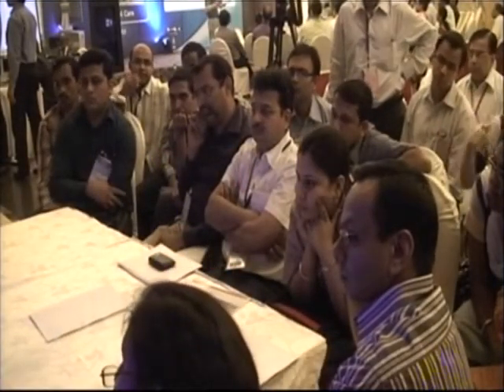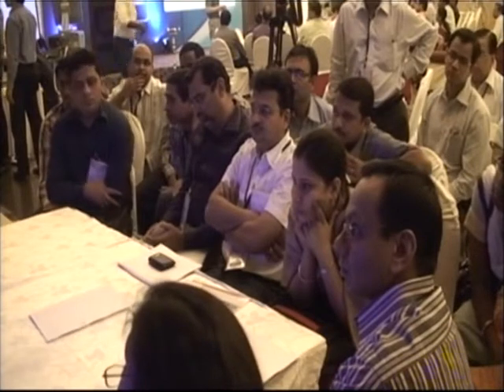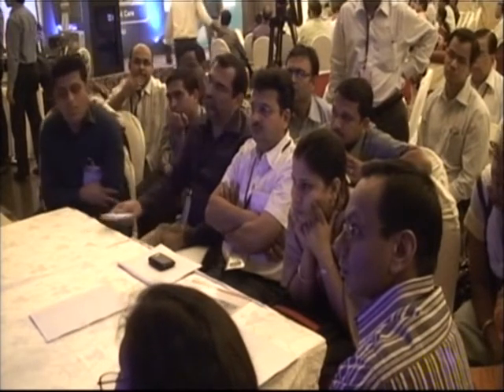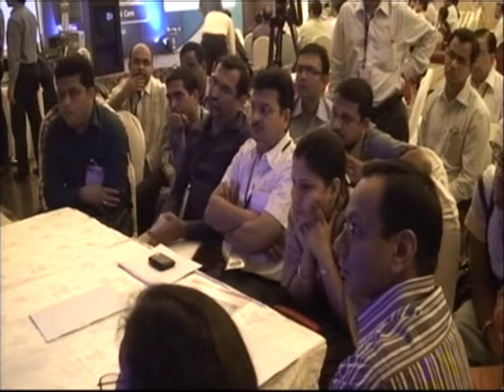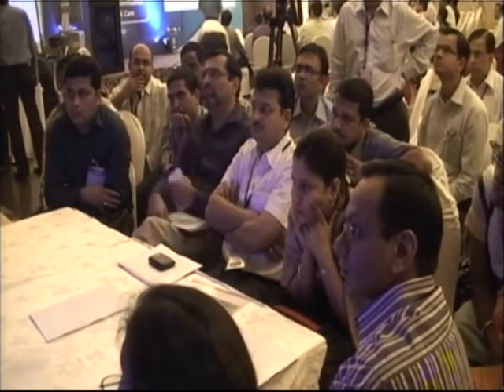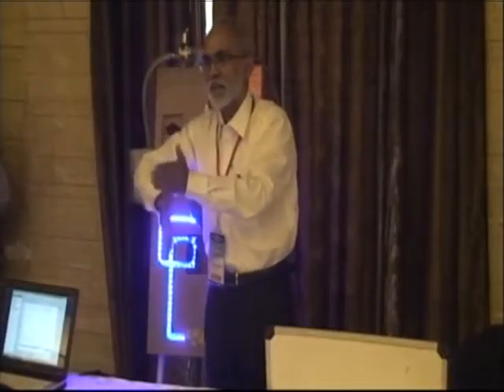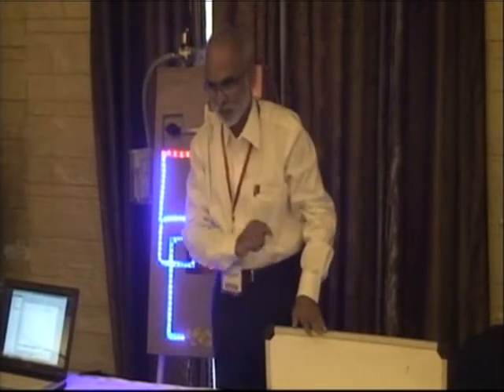This is a typical graph of a pressure control ventilation, the pressure level. The flow is different. Flow on a pressure ventilation goes up like this, decelerates till the time the inspiration ends, then goes below the level and then comes back to the baseline level. This kind of graph I will show you drawing on this.